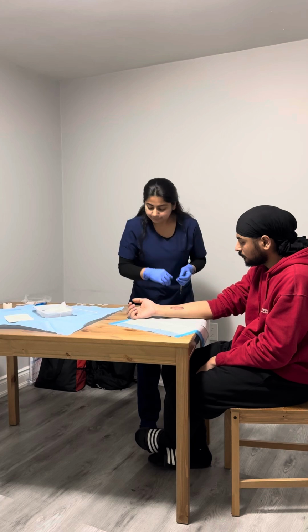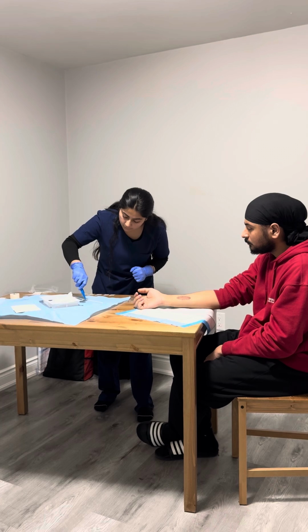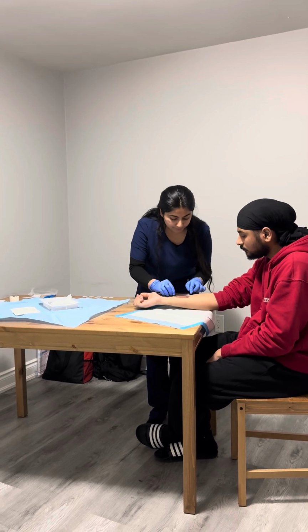Okay, and then I'm gonna check the length of the wound with the Q-tip. So I'm going to use this Q-tip, I'm going to place this back. Okay, I'm going to check the length.